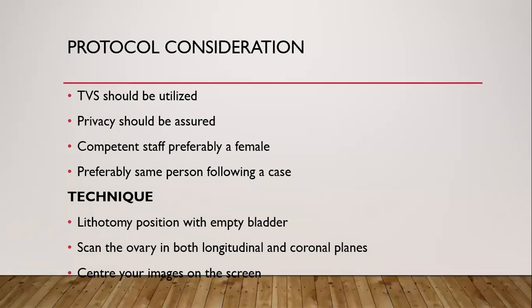This is not very important, but we can try to see to it that we get to have one person following a case. So if it is, let's say, me following a case, when I do the baseline ultrasound, I should be the next person to do the serial scans. And as I get to do the serial scans on a daily basis, or probably after 2 days, whichever schedule that we get to set on our own, I should be the same person.